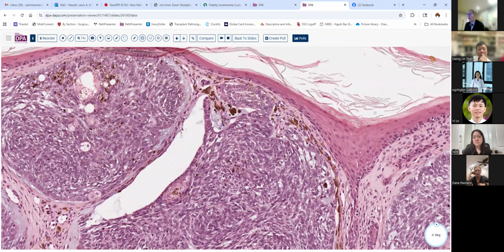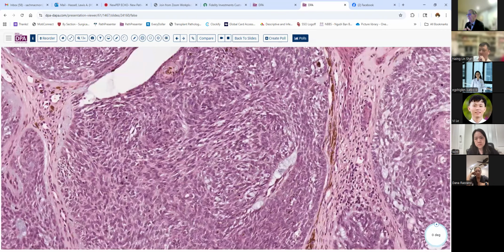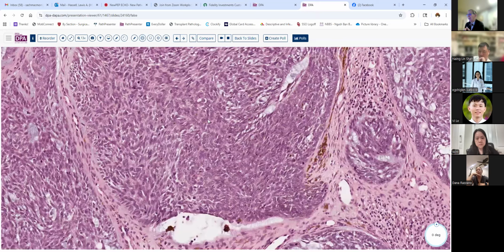Exactly. There are alternate chromogens that can be used with the same antibody that can be more readily distinguished from the brown pigment to avoid a false positive interpretation. So you want to be aware of that and alert your laboratory to the need to use the red chromogen rather than the brown chromogen for your assay.